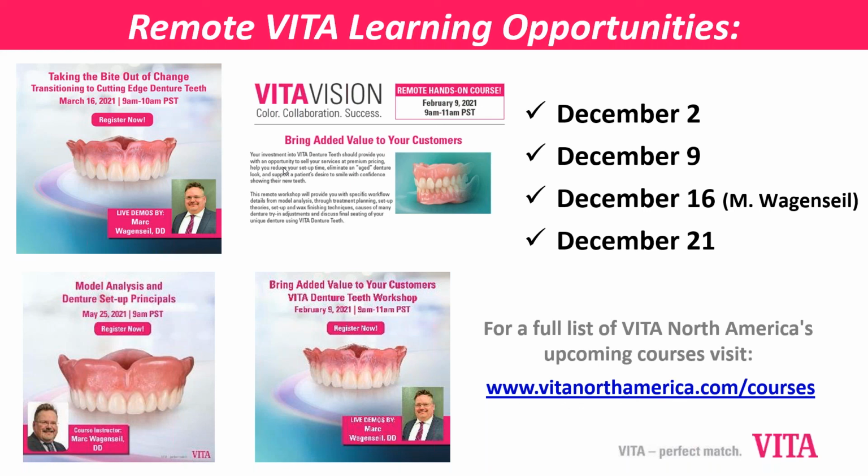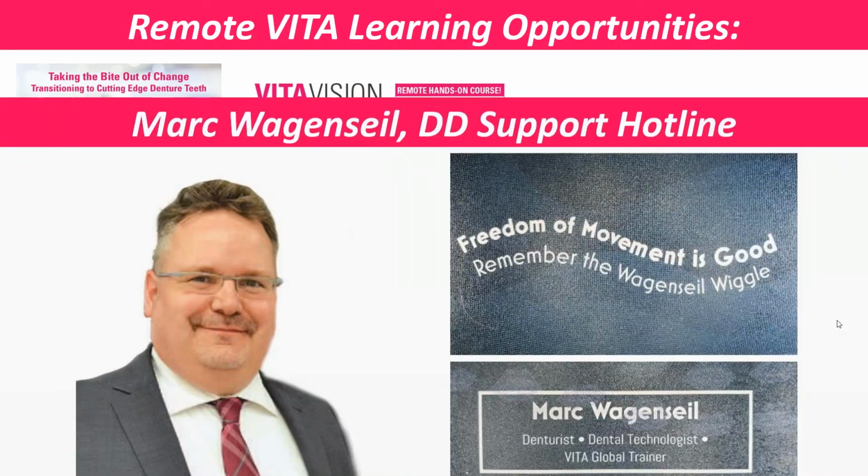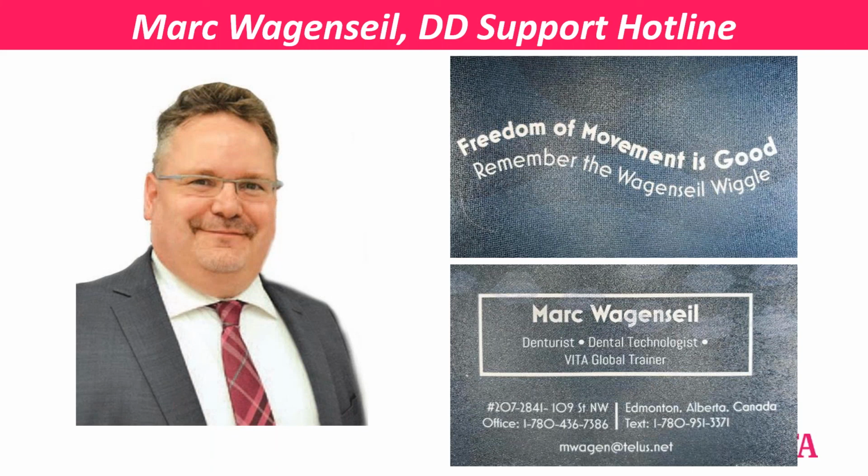Right. Another question is on the hit and slide. When you find that there's a hit and slide, do you usually burr modify the upper or the lower? Yes. You will almost always do the guiding plane on the bottom. I don't ever want to cut the big cusp on the top. Sometimes you might catch a guiding plane there, so you might have to do it a little bit, but you never ever want to touch the tip. Most of it's always on the lower, and yes, the odd time on the upper. Again, just to show you, that's the cutter right there, and maybe a little bit in here on that buccal cusp where it overlays.